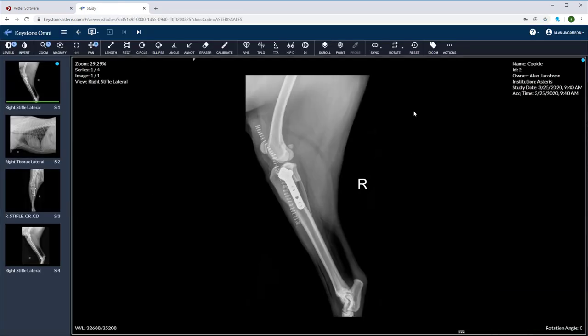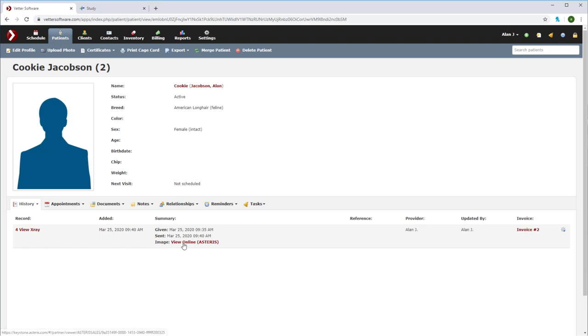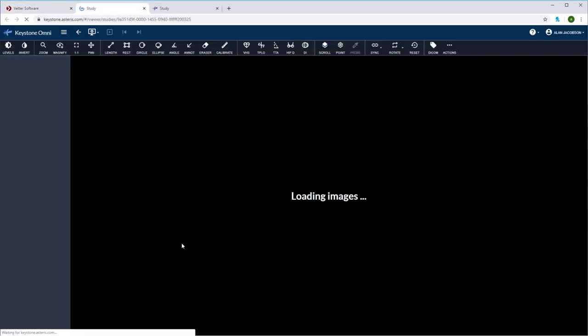The captured images are now available in both keystone and the Vetter patient record. We can easily launch the keystone viewing platform from the Vetter patient record by clicking on the four view x-ray record and view online Asteris.